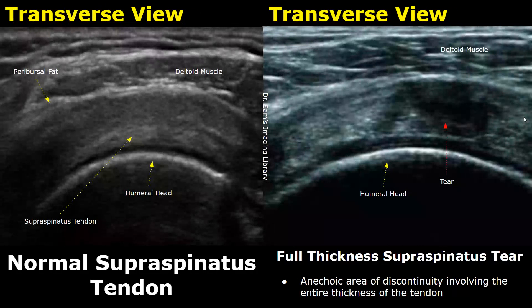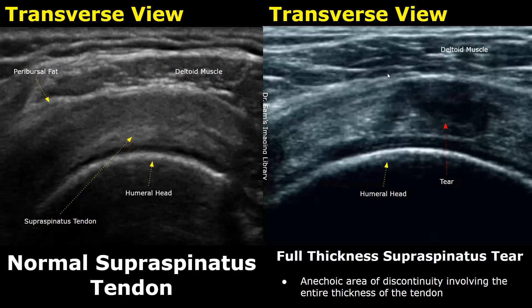Here is another image of a full thickness tear. We can see a large anechoic area extending from the bursal side of the tendon all the way to the articular side. The upper side is the bursal side because it is next to the subacromial bursa, and the side near the humeral head is the articular side.